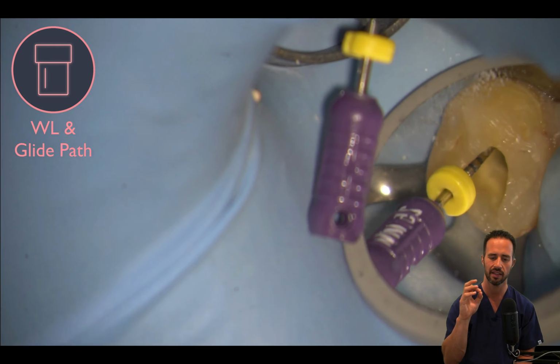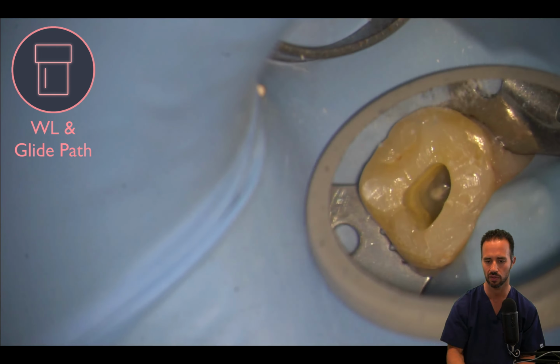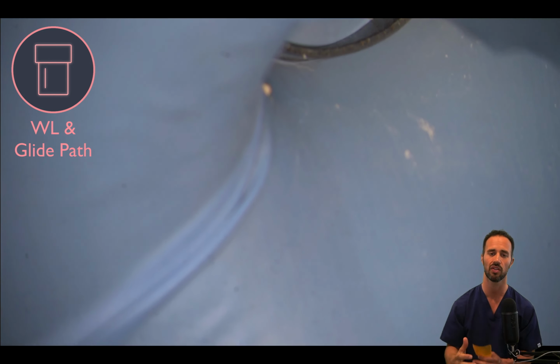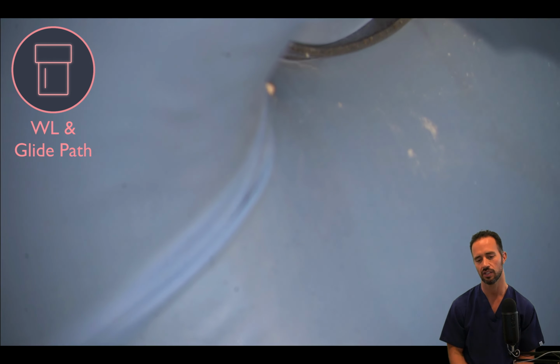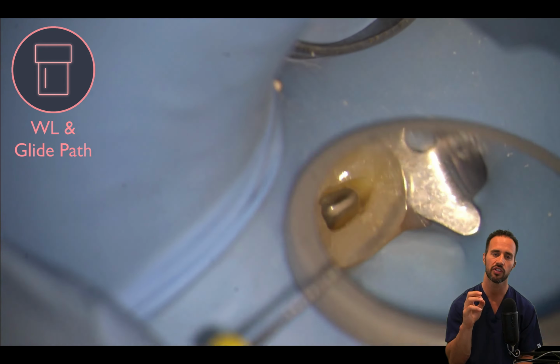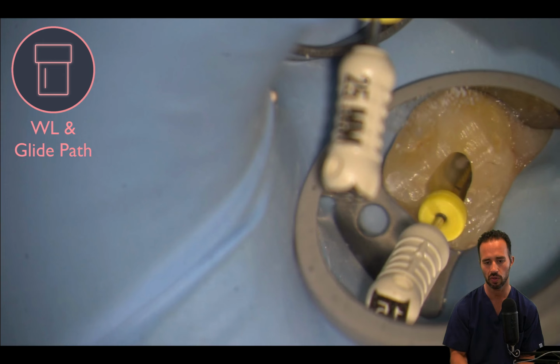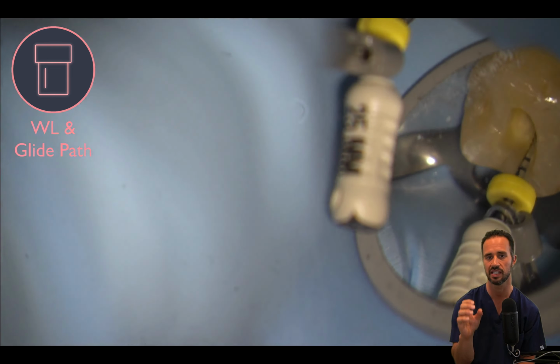And now we're going ahead and taking our measurement in the palatal canal, and in this case, I'm going to be discovering that the palatal canal is huge. And so remember, when you're determining what your working length is with your electronic apex locator, you need the file to be snug.